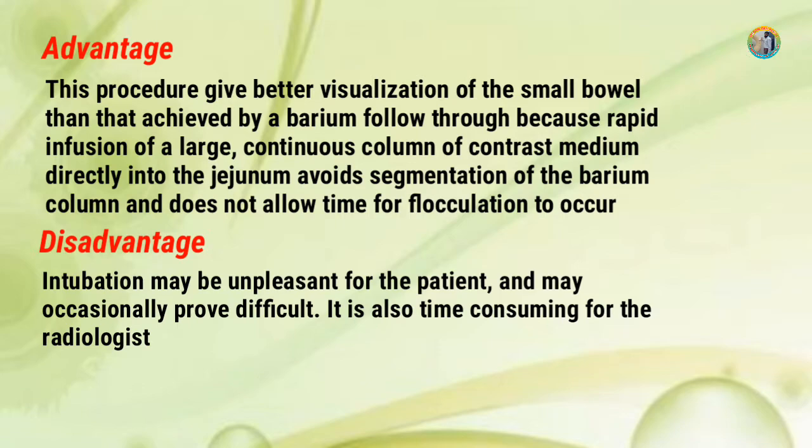Disadvantages: intubation may be unpleasant for the patient and may occasionally prove difficult. It is also time consuming for the radiologist.